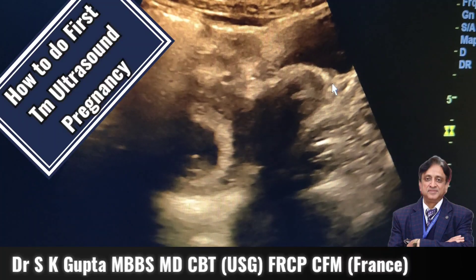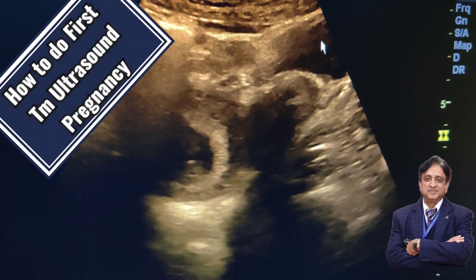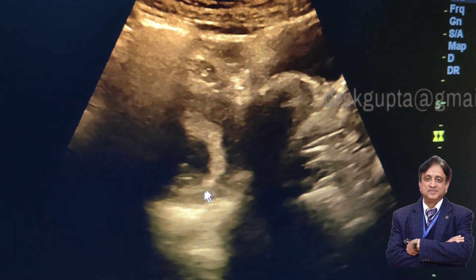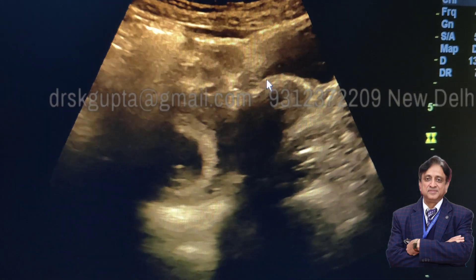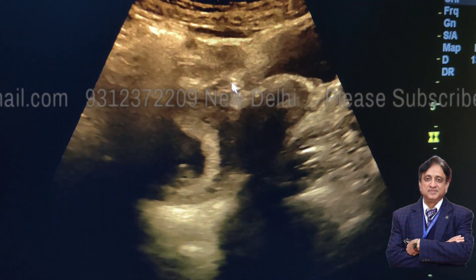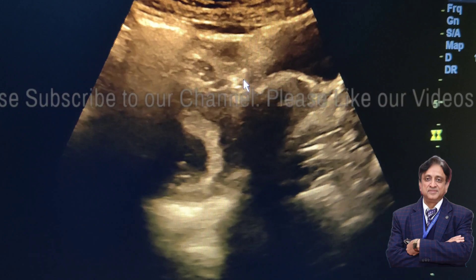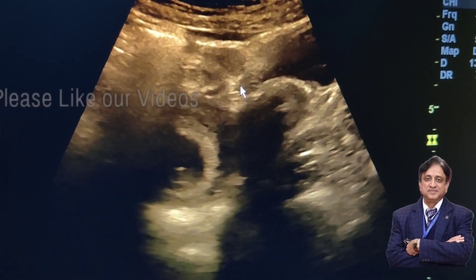You can see the bladder of this patient is empty. This is the uterus and this is the gestational sac. The gestational sac is not very well visualized because the uterus is hidden behind the abdominal structure, and once the urinary bladder becomes full there is a good acoustic window.